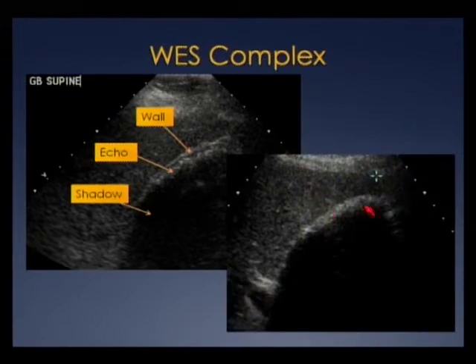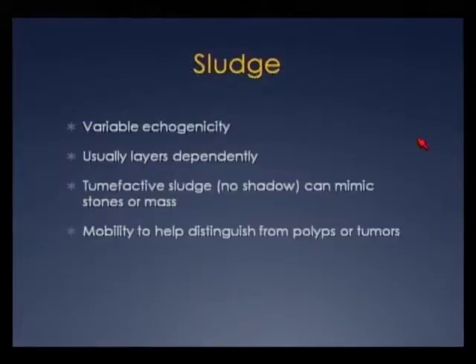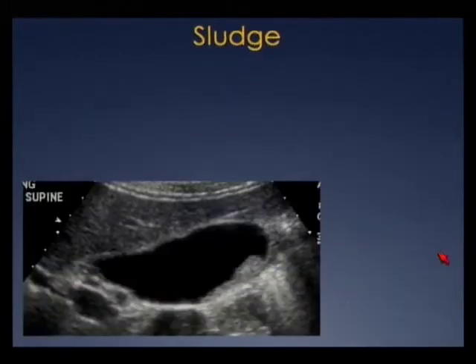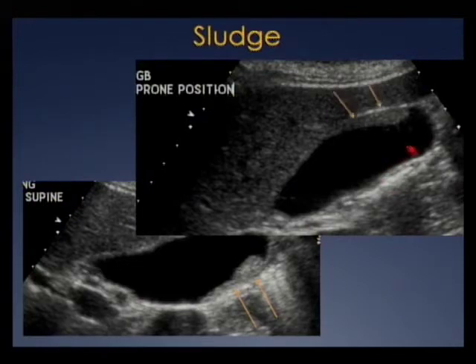Sometimes the echogenic wall and echogenicity of the stones combine into a single echogenic line with just the shadow. Sludge can have variable echogenicity and usually layers dependently. Tumefactive sludge can mimic stones but should still move, so mobility helps distinguish it from polyps or tumors. Here's a sagittal image with polypoid echogenicity — we didn't know if it was a lesion or sludge. We moved the patient and put them prone, and the morphology of the sludge changed — confirming it was sludge and not a lesion.